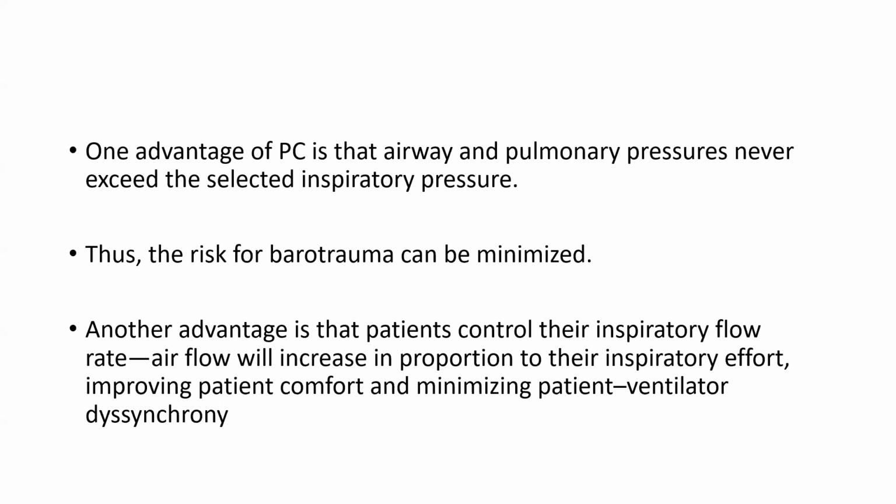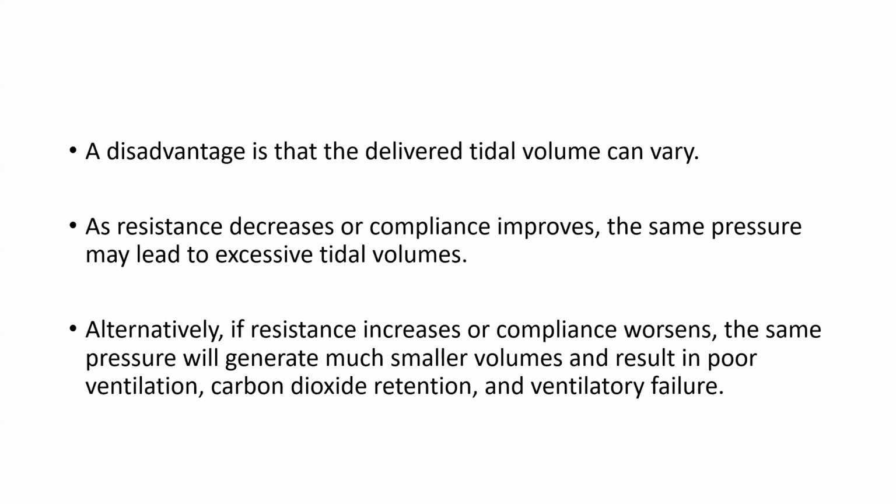One advantage of pressure control is that airway pressure and pulmonary pressure never exceed the selected inspiratory pressure, so the risk of barotrauma is minimized. Another advantage is that patients can control their inspiratory flow rate; airflow will increase in proportion to the inspiratory effort, improving patient comfort and minimizing patient-ventilator dyssynchrony. A disadvantage is that the delivered tidal volume can vary.